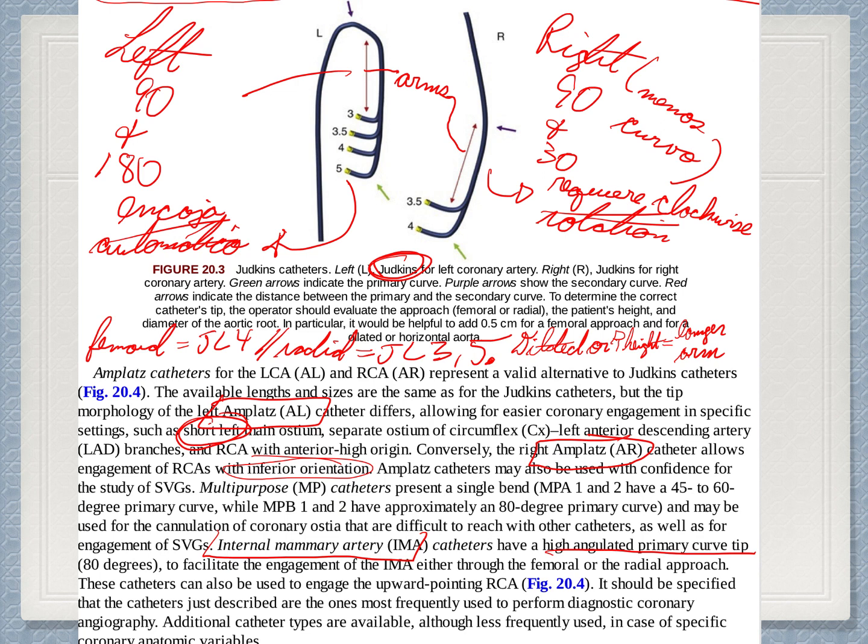Then the left coronary usually goes into the coronary ostium in an automatic manner, while the right coronary needs an extra step, which would be clockwise rotation. So, probably or hopefully easier for a resident in practice or someone who is starting off would be the cannulation of the left coronary artery.